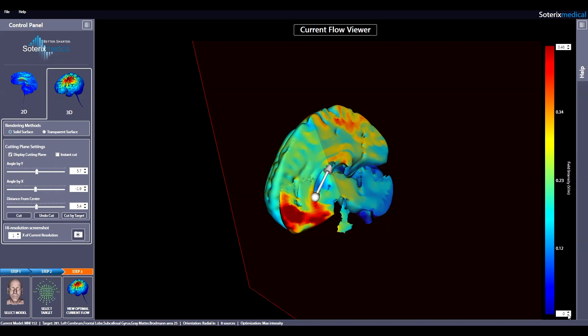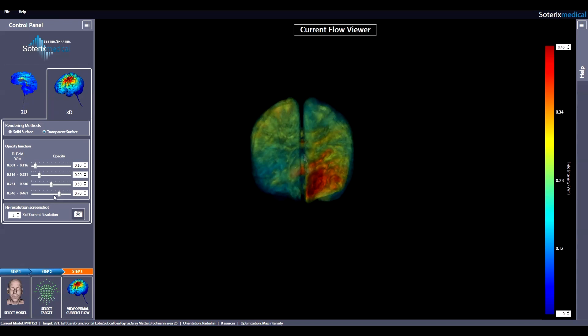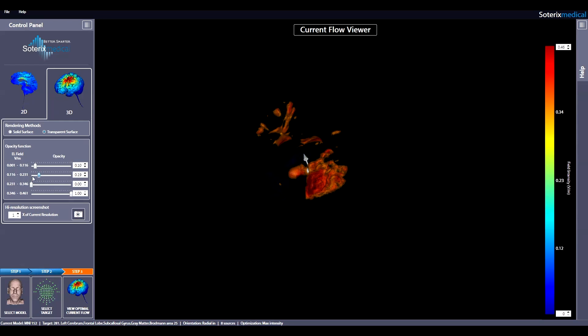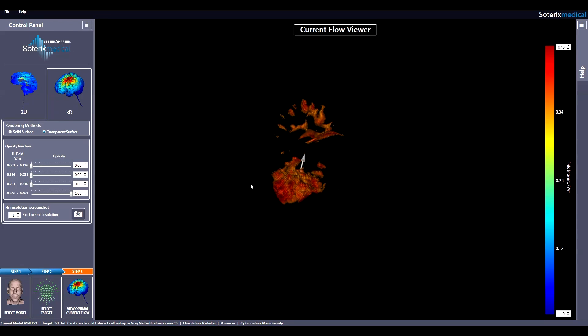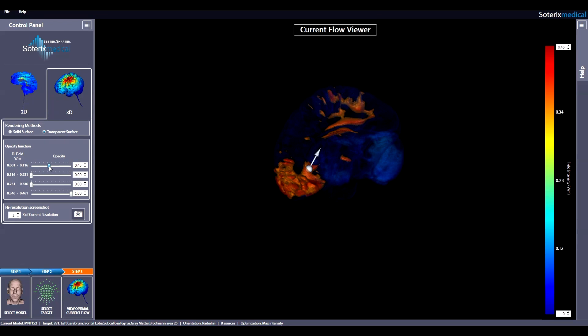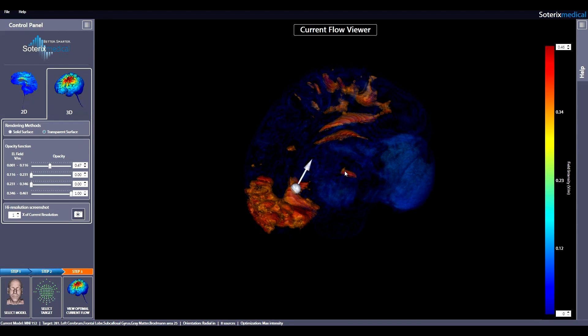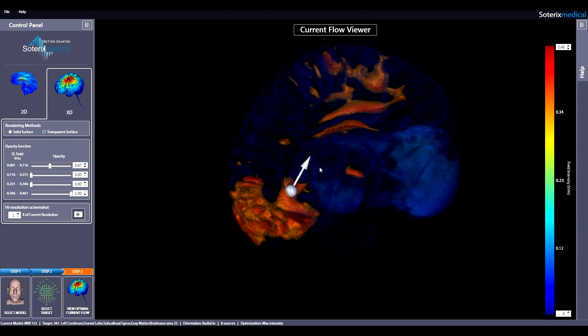Now let's take a look at the transparent surface rendering. As you can see, the opacity function section allows you to set the opacity of 4 different electric field ranges, independently of one another. The ranges are determined by splitting the maximum electric field intensity value on the color bar into 4 divisions. For example, for viewing the volume of the brain where the top 25% of maximum electric field intensity is induced, you would set the opacity to 1 in the last range, while setting opacity to 0 in the other 3 ranges. You can then make the lowest 25% semi-transparent to better appreciate the extent of the maximum 25% electric field distribution. The target and desired orientation is shown at all times.